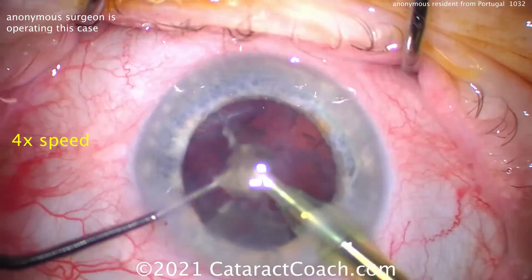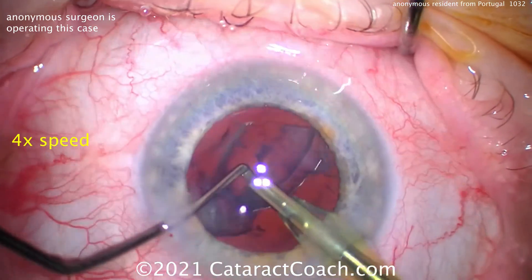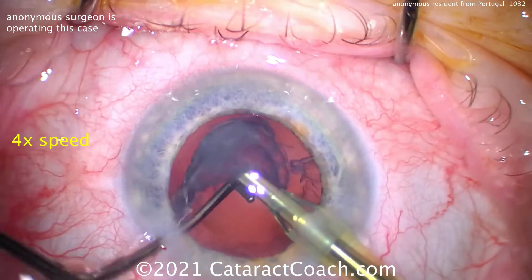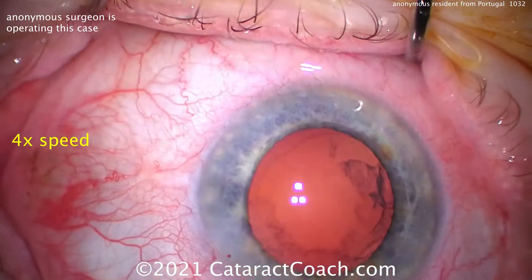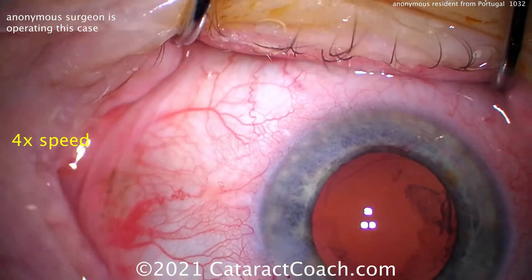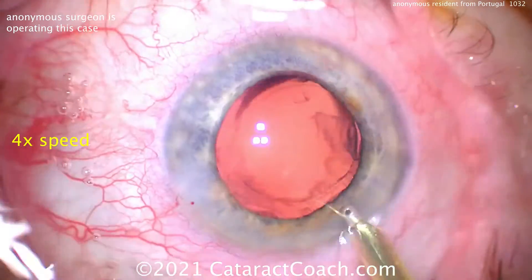Now the draping could be better. Look at the lash margin there — look at the eyelashes in the field. I know that if you want to have your own surgery done, or you're doing your mom or dad's cataract surgery, you want the draping perfect. Well, so does your patient. Remember, we want to give the surgery that we'd want to receive. See the lashes there? That's the source of endophthalmitis. You want to minimize those risks.